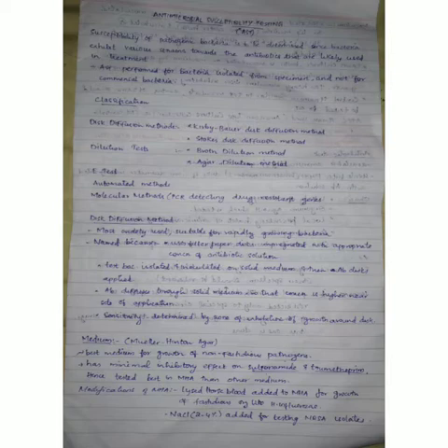Susceptibility of a pathogenic bacteria is to be determined because it is the liability of the bacteria to be influenced or harmed by anything. Here, what harms the bacteria is the antibiotic. So we have to understand how much the antibiotic can harm the bacteria, and according to that we will select our treatment methods. This is why we perform antimicrobial susceptibility testing.